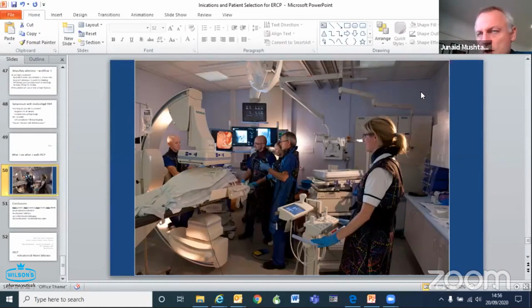So what is the position of the patient once sedation or GA is given? The traditional way is what I would term prone. Some of our anesthetists call that the swimmer's position. They're not lying flat as such, but lying prone, more looking towards the right-hand side. Lying prone in that position is optimal, and there is a reason for that. It opens up the duodenum and gives better access into the duodenum.